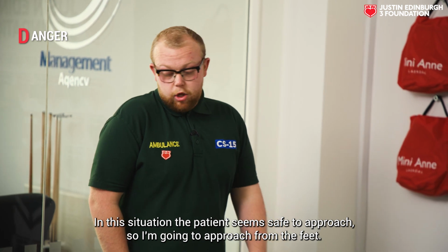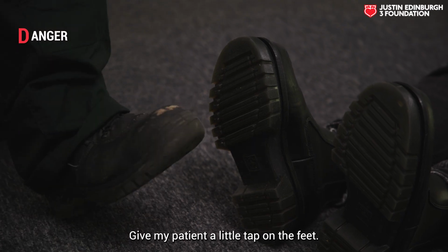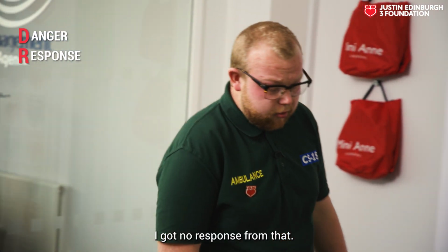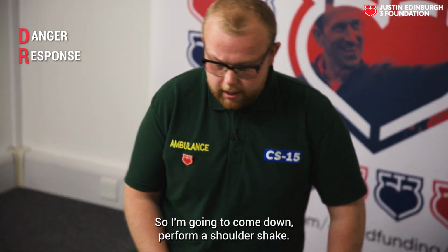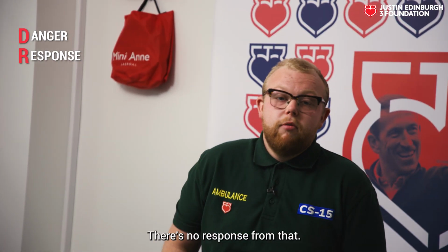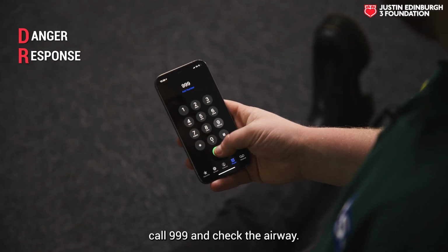In this situation, the patient seems safe to approach, so I'm going to approach from the feet and give my patient a little tap on the feet. Open your eyes for me, can you hear me? I got no response from that, so I'm going to come down and perform a shoulder shake. Open your eyes for me, can you hear me? There's no response from that, so I'm going to get my phone out, call 999 and check the airway.